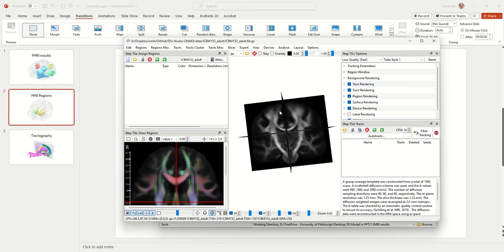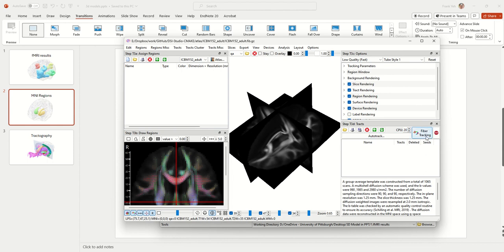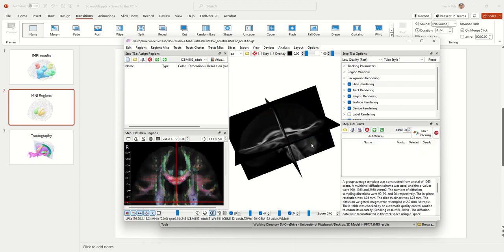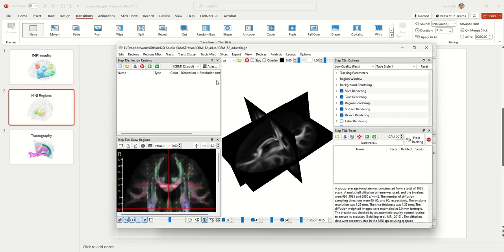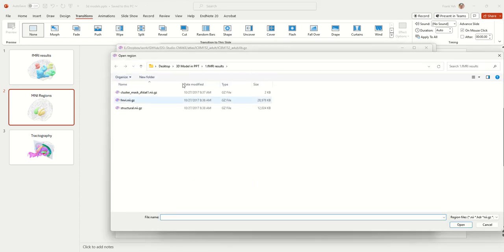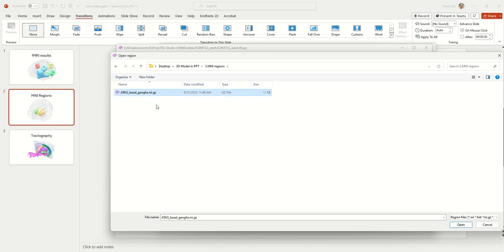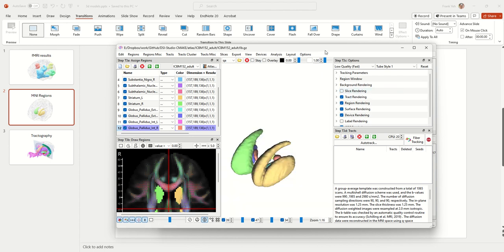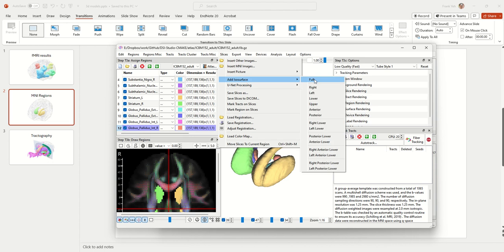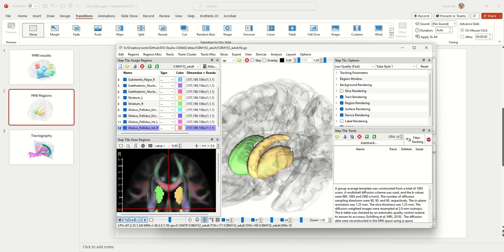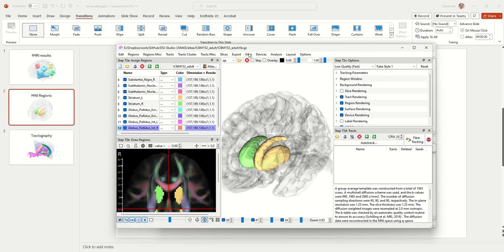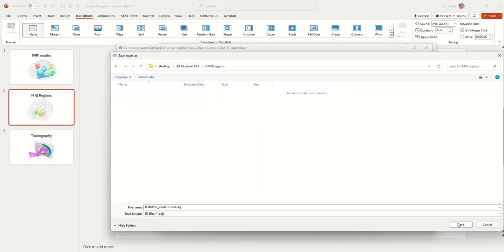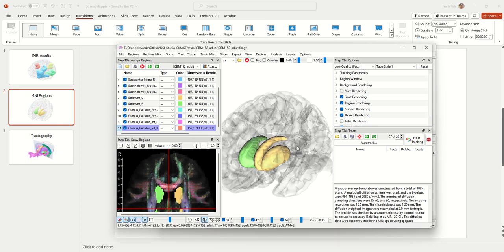Once you're in the MNI space, you can go ahead and click the region you'd like to open. There's an online region file — go ahead and open it and you'll see it looking nicely. At the same time you can also add an ISO surface, for example loading the entire brain surface. Then similarly, go to the View menu, click Save 3D Model, and save another OBJ file to insert into PowerPoint.